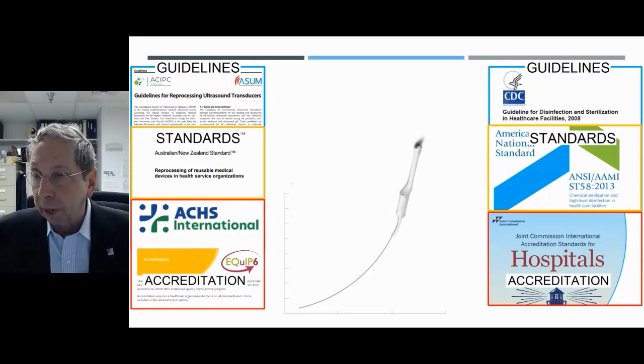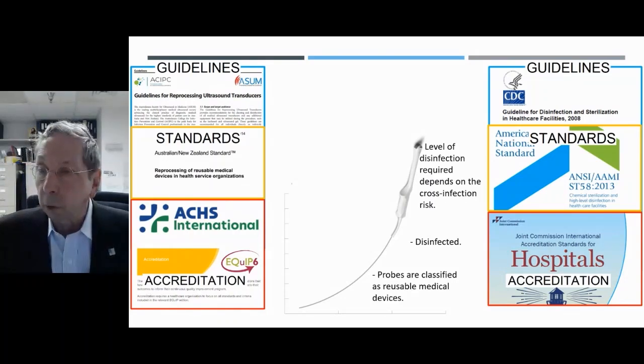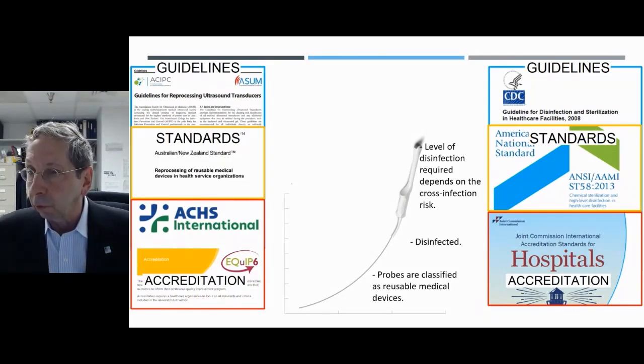As you can see here, we have a picture of an ultrasound probe. Probes are classified as reusable medical devices. They must be disinfected between patients to prevent carryover of microorganisms from one patient to another. The level of disinfection required depends on the cross-infection risk.